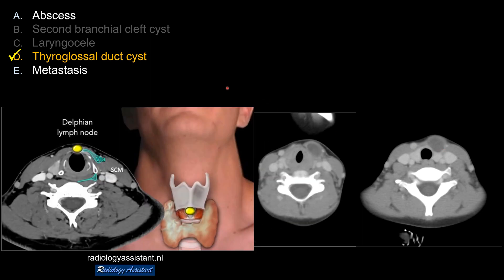It is true that some cystic nodal metastases can look rather benign, so you do want to be careful in real life. If you suspect a cystic nodal metastasis coming from level six, there can be a midline node called the Delphian node. If you see a cystic nodal metastasis in this region, you want to inspect the thyroid gland — papillary thyroid cancer can metastasize here. Sometimes laryngeal carcinoma extends through the anterior commissure, causing enlargement of the Delphian lymph node.